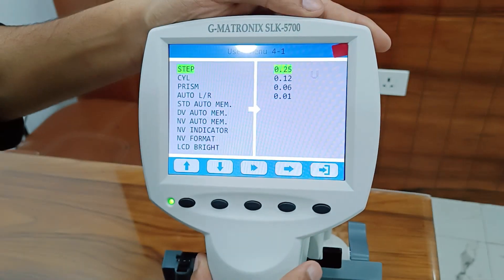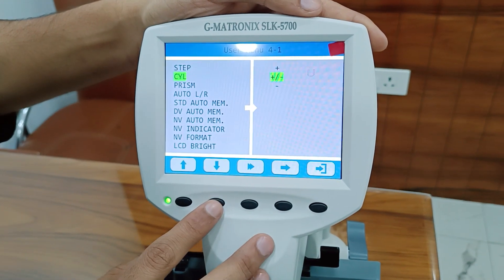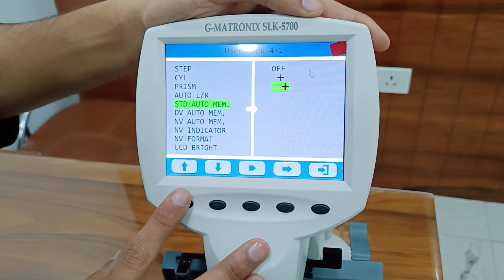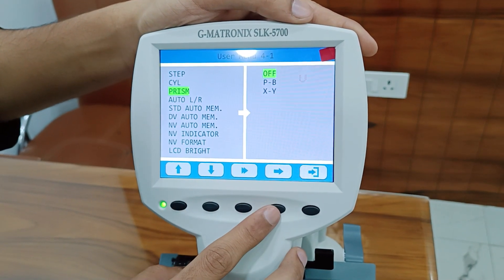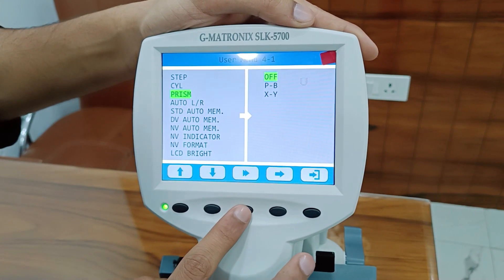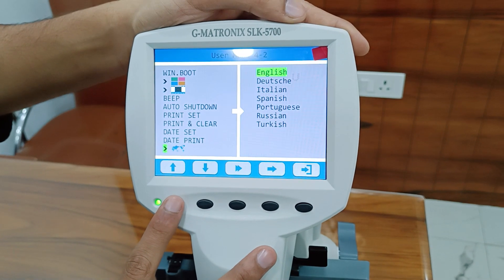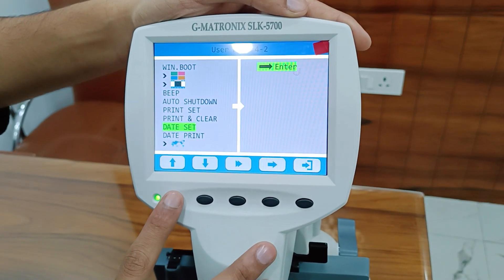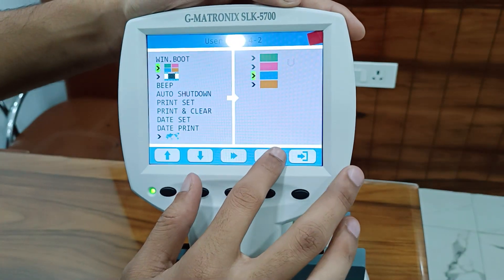There are up and down buttons, an enter button, an exit button, and a second menu button. You can make settings like display color and display options from this menu.